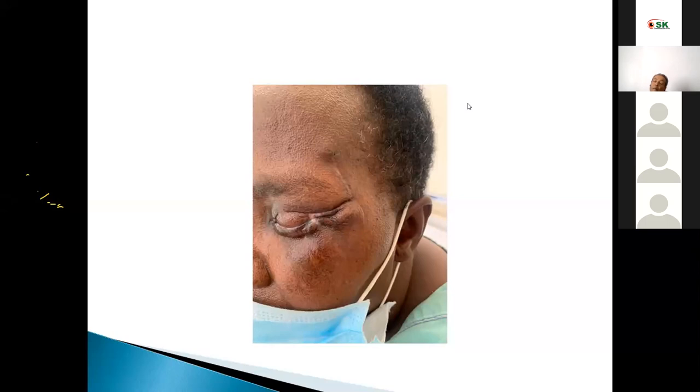Now, the use of a monocanalicular stent is that you identify the punctum itself, where it is. You pass the stent through the punctum until the monocanalicular stent fits very well into the punctum itself. Then you go back and identify the distal end of the laceration, and you pass that stent over there. When you do that, you then suture the tissues around. You don't have to suture the mucosa so much, but the tissues around there, and approximate them well such that the mucosa from the other end also touches the other end. Then after the repair of the tissues around there, you do the lid margin, and you wait between a month and 6 weeks, and then you remove the stent. That is the easiest way I've seen for repair of canaliculi that I have always preferred.